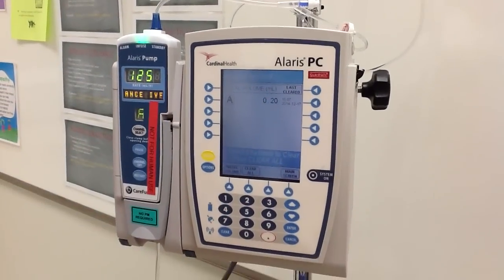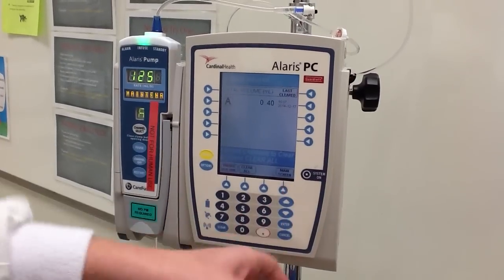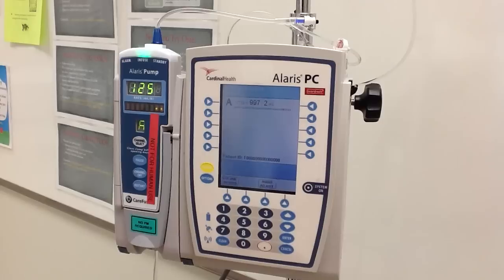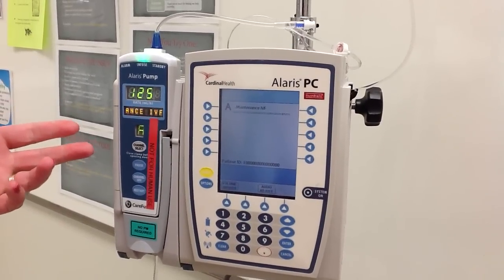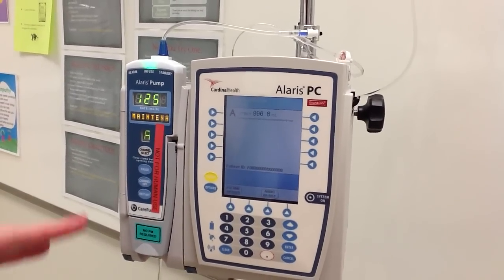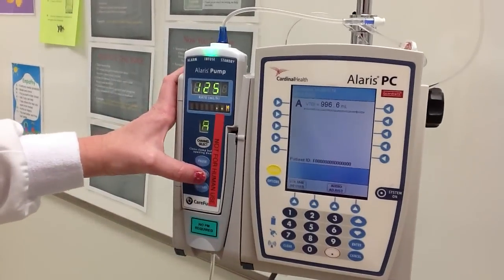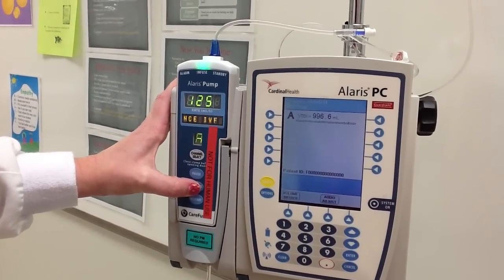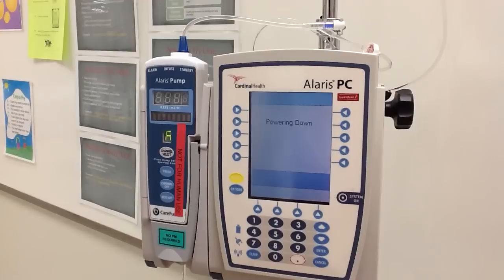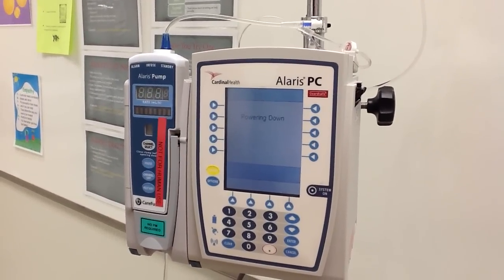You would do that at the end of your shift. Once you have cleared it, you can go back to your main screen, and it's going to tell you which channel is running, your rate, and how much has infused. When you are finished with your IV or it's been discontinued, you can hit the channel off button and hold it for a few seconds. Once it has beeped, you can release the button and it'll power down. And that is how you operate your Alaris IV pump.